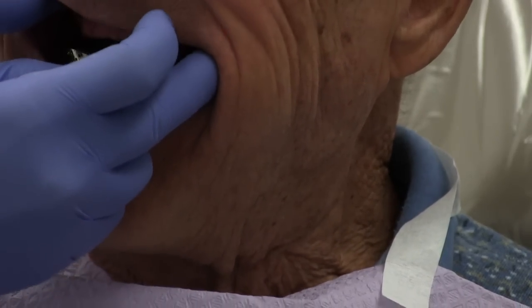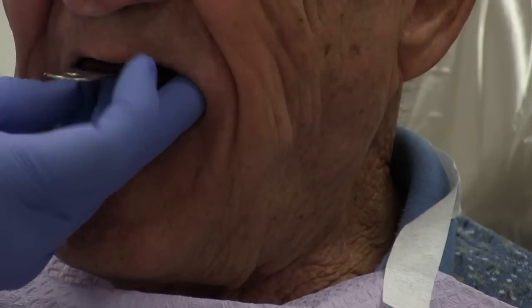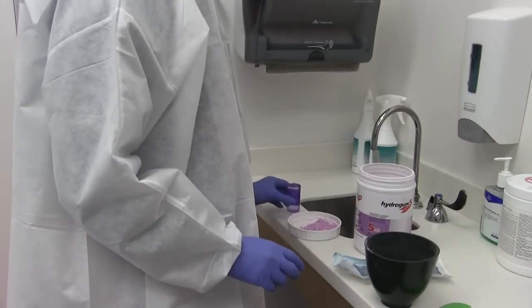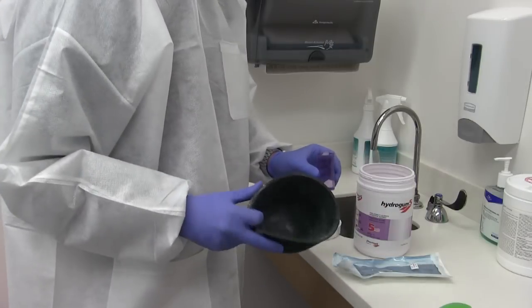This one I'm putting in is a little bit smaller. What I want to provide is about a quarter of an inch, or about five millimeters — half a centimeter — of extra space between the patient's maxillary jaw and the tray.